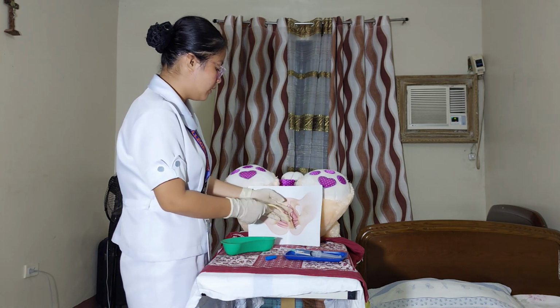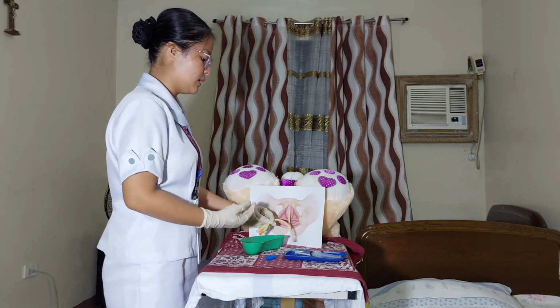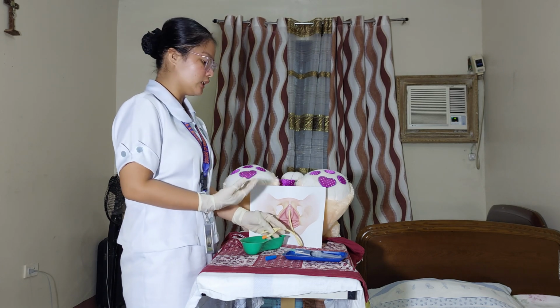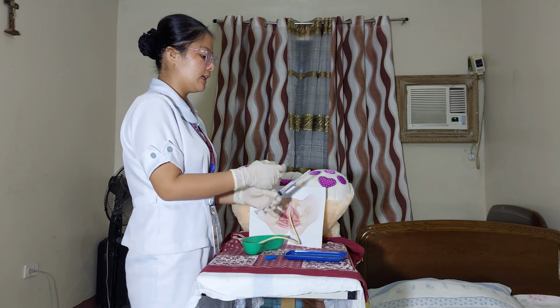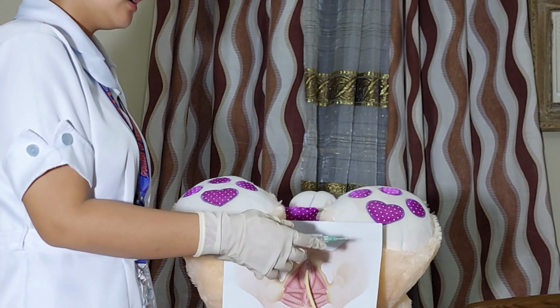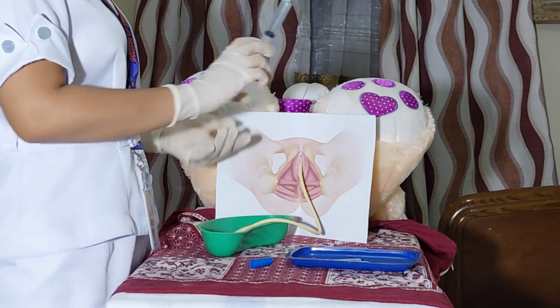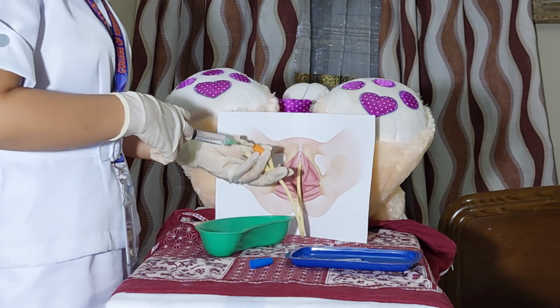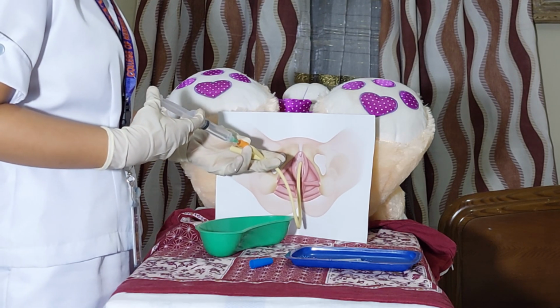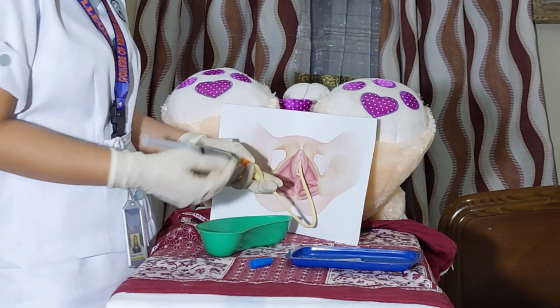So okay. So now po, now that may positive outflow na po or output na sa kidney basin. So para po ma-secure natin yung acting Foley catheter is I'm going to instill a 10 cc saline solution or sterile water. So make sure na walang bubbles dun sa ating syringe. And ngayon ipapabalo na natin yung Foley catheter. Papabalo na natin yung indwelling catheter.